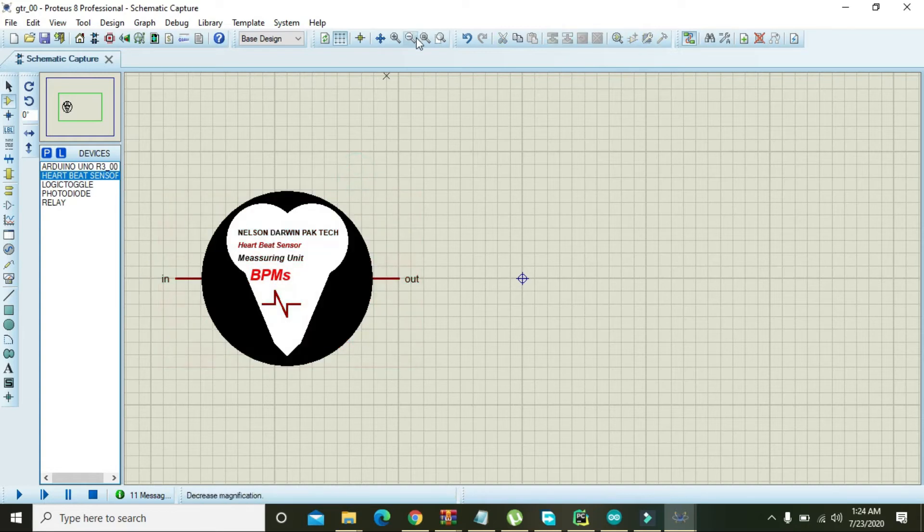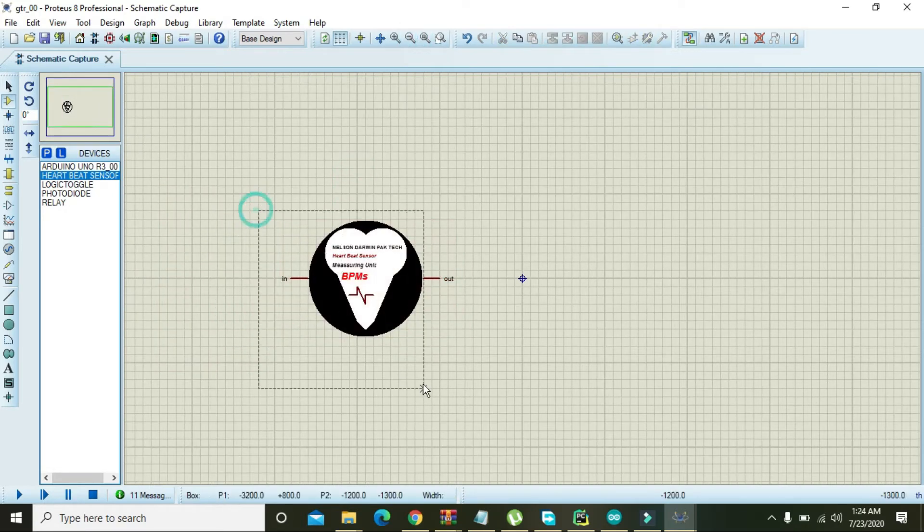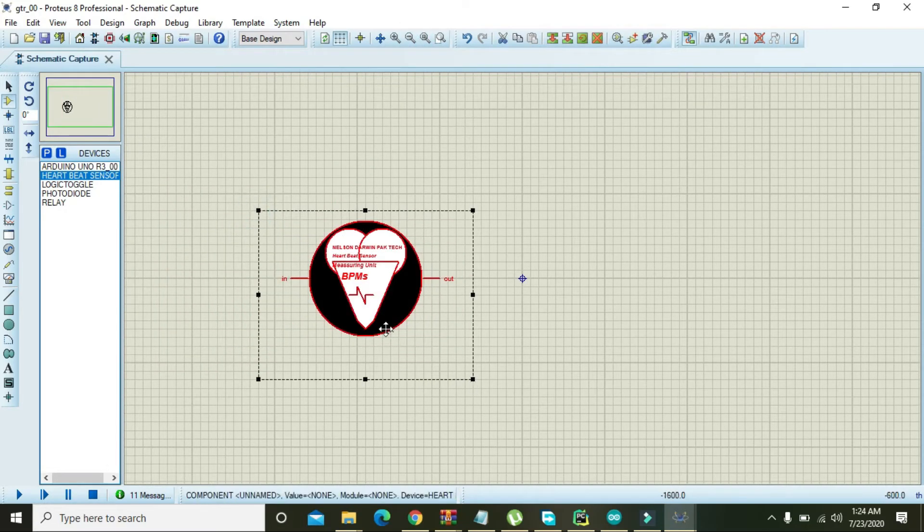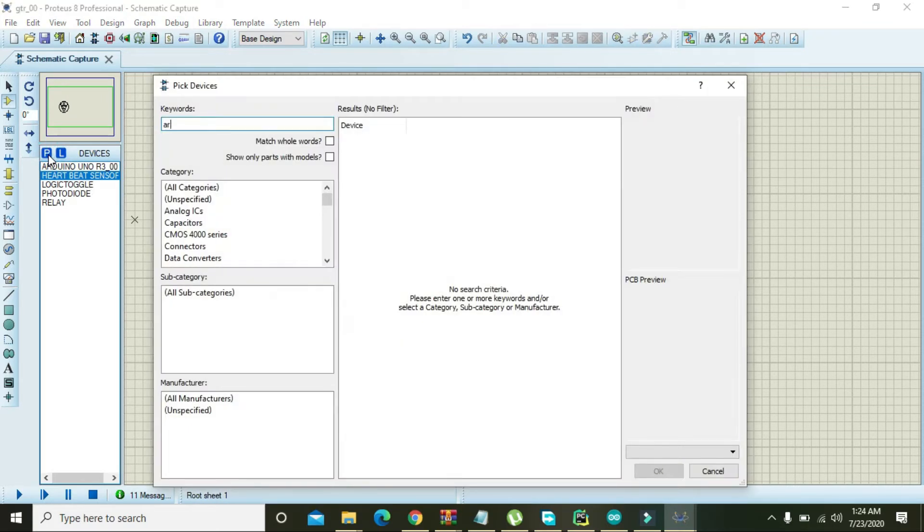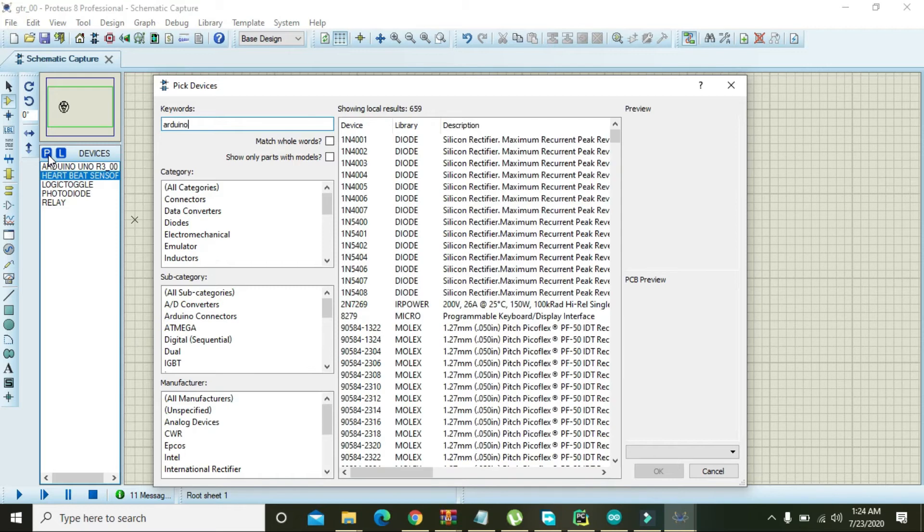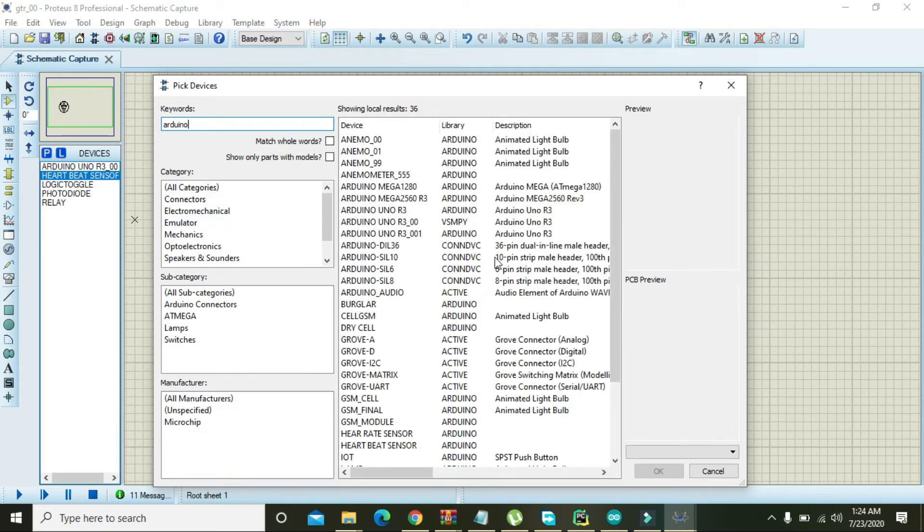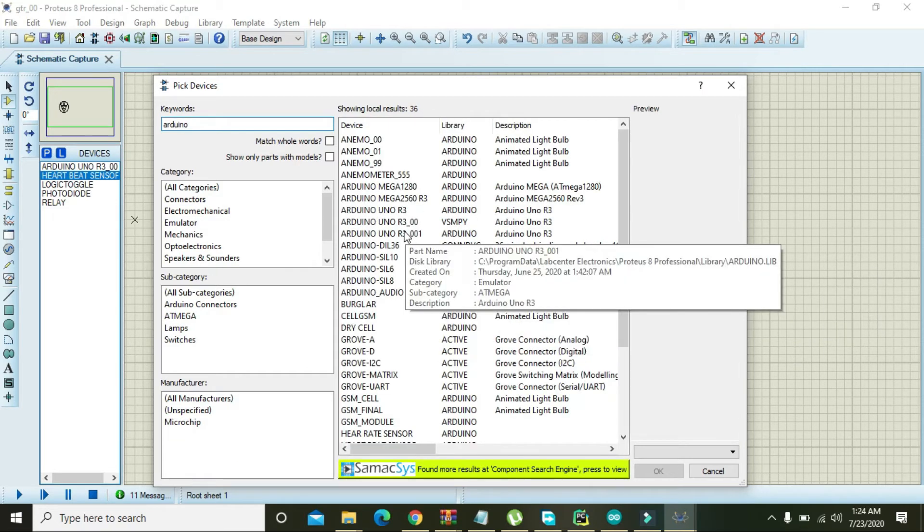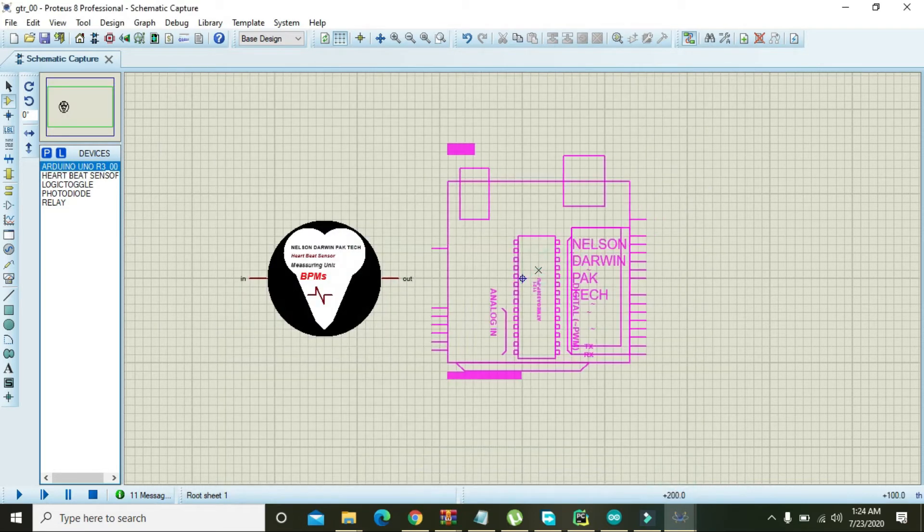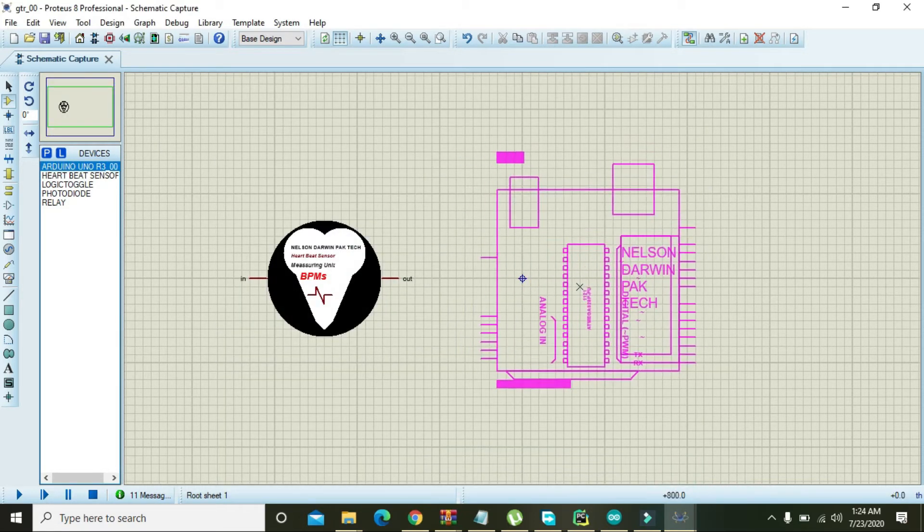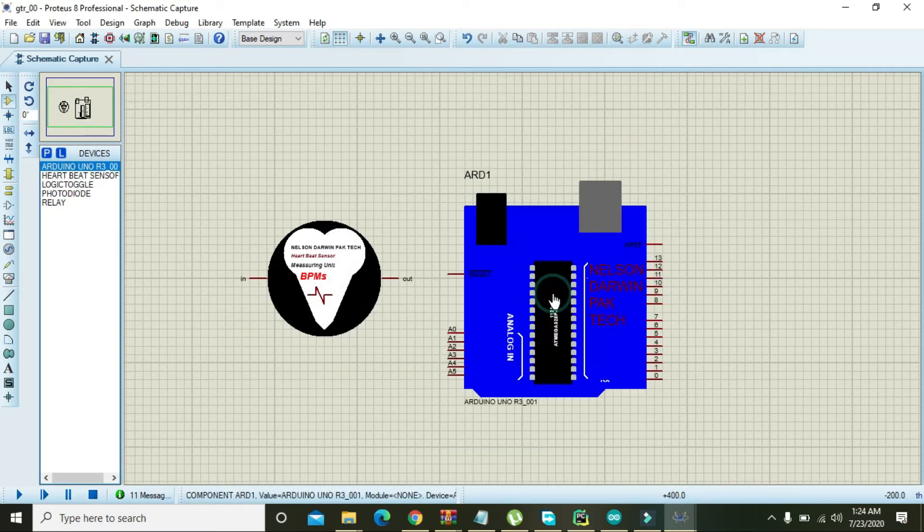Or like this, okay this is okay I think. Okay, now take, go and right here the Arduino, and here we will use Arduino Uno.